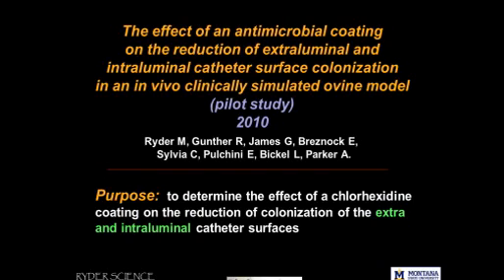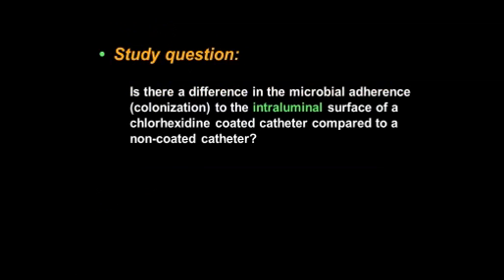The purpose of the studies was to determine the effect of the chlorhexidine coating on the reduction of colonization of both the extra and intraluminal catheter surfaces. This required 2 independent studies because it is not prudent or not possible, basically, to study both surfaces at the same time.